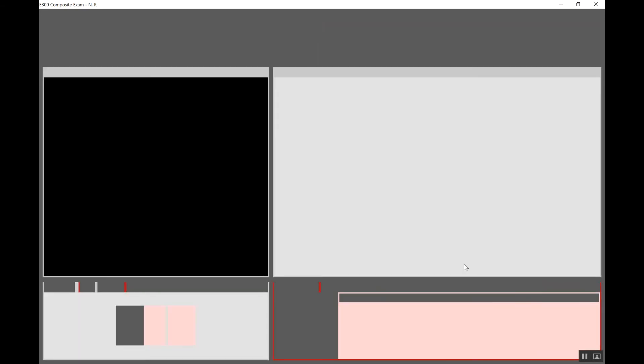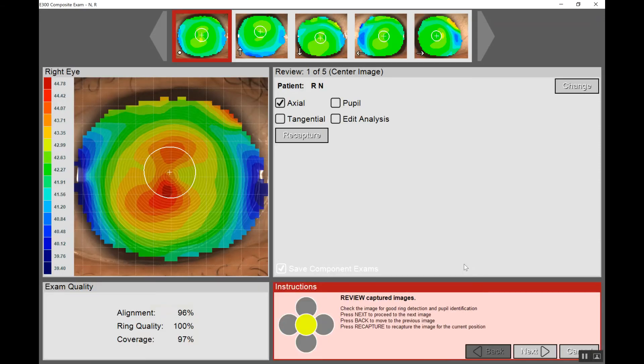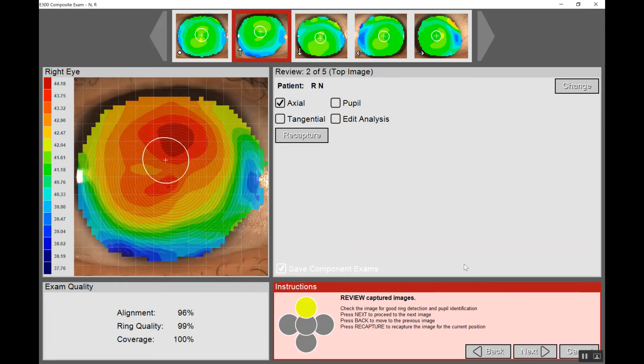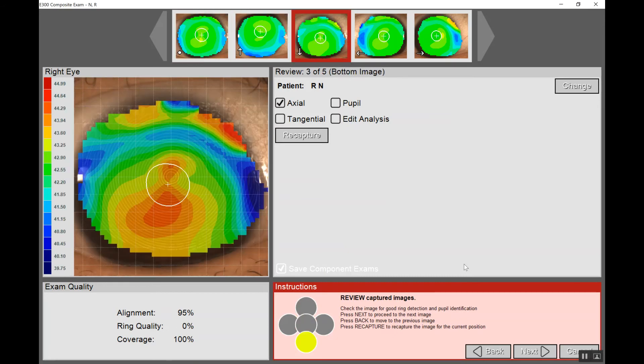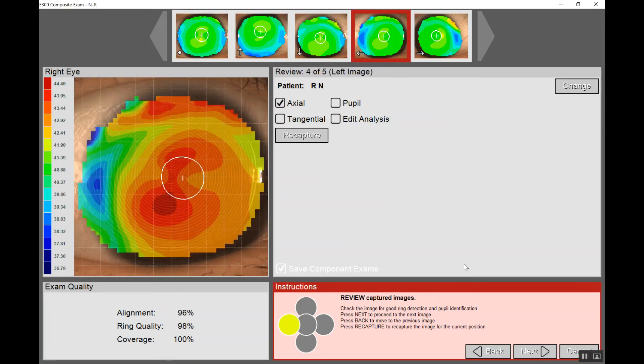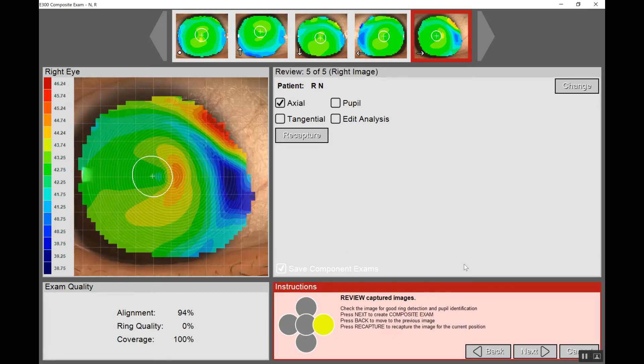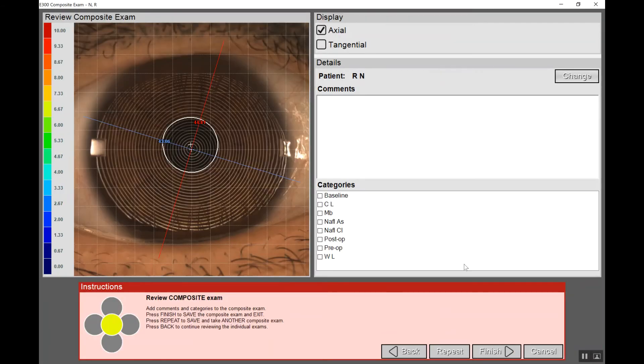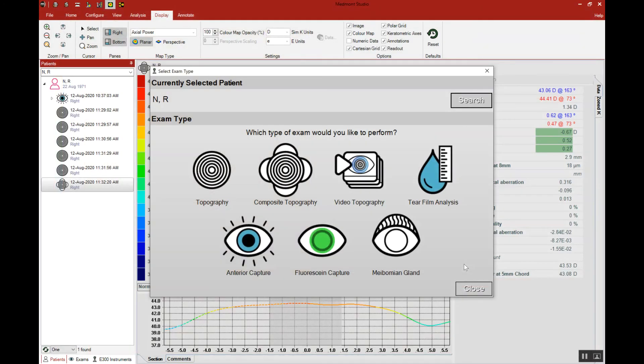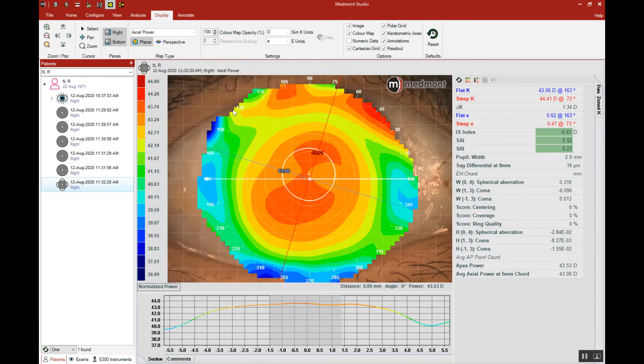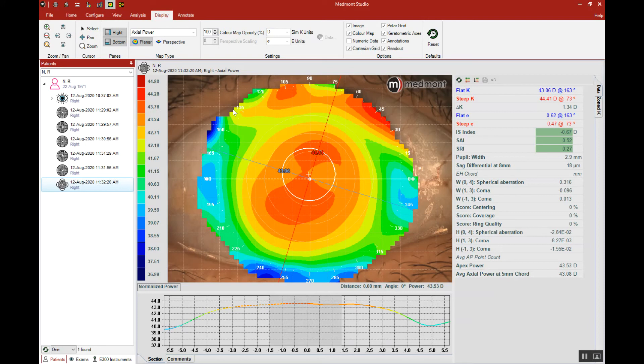Next the software is going to analyze each image and ensure that it has a pupil. The pupil is used to merge all of the captures together. So we can click the right arrow to go through each one of these images to ensure that we're happy with the capture. When it's finished we can again click the right arrow and that will calculate the final composite image. This composite capture has now merged all of those five images into one, creating this view of the entire corneal surface from limbus to limbus.